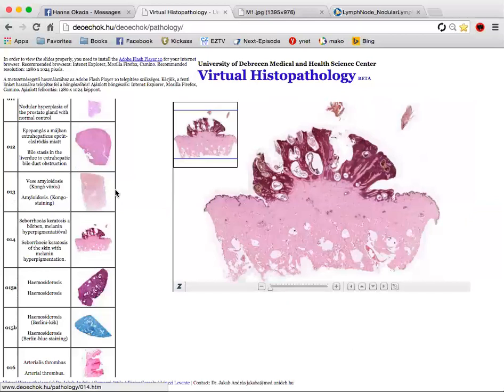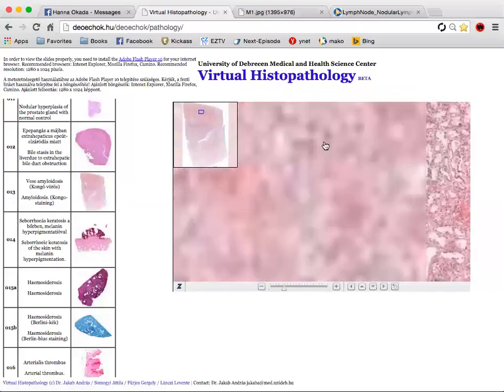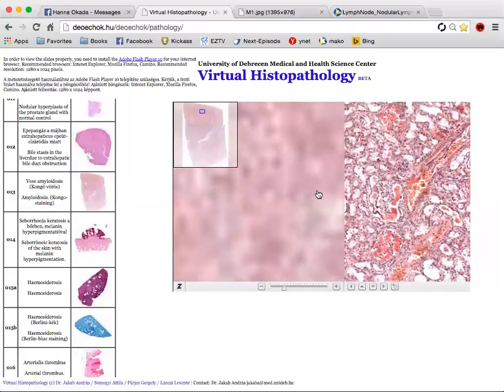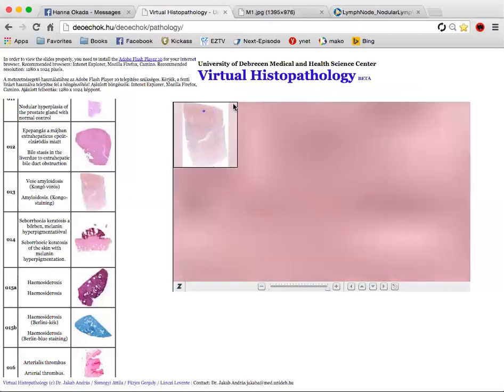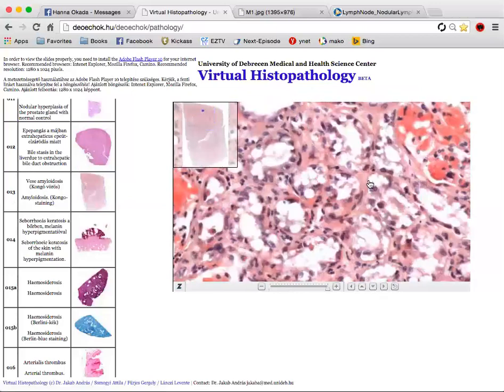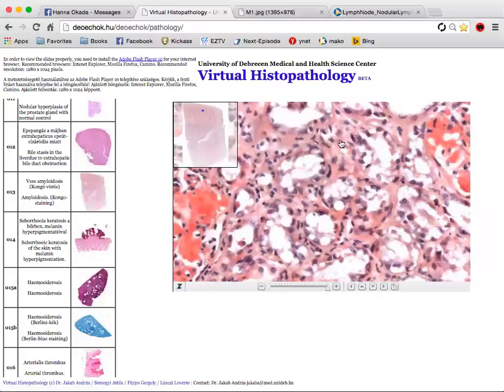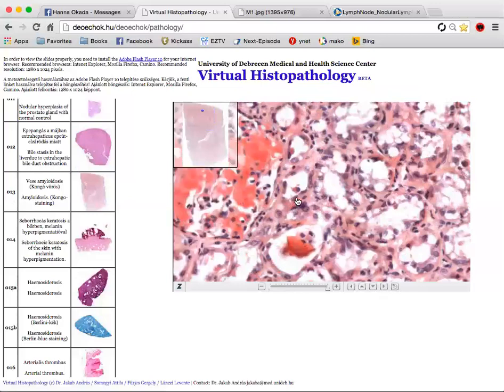Could you show me again the lesion of the afferent arteriole? Yeah, you can't really see it very well here. You're going to need the polarized light. So you can see these areas that are more darkly staining here. Okay. Got it. Yeah. Thank you.